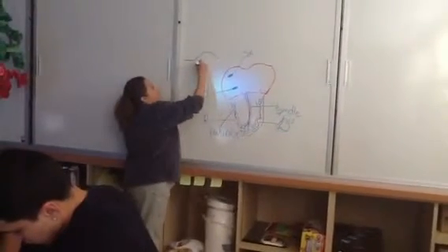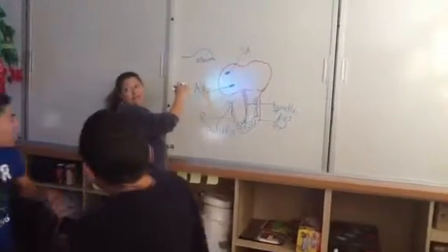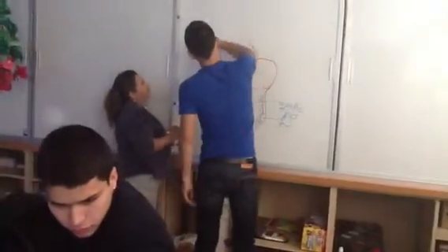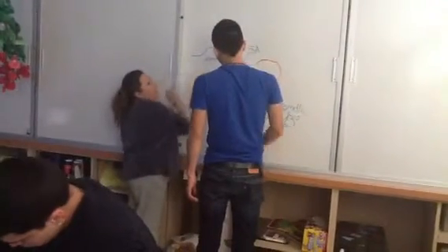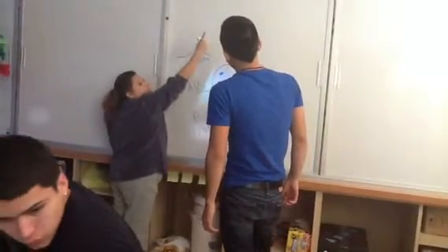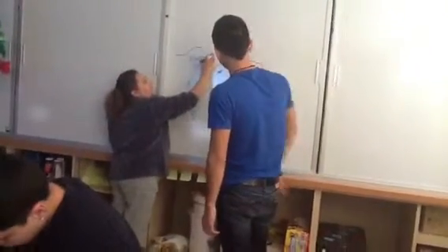So this is your atrium contracting. So this is the top half that contracts. So SA, AV is all in one. If this one takes longer, it'll be wider and flatter. So then it'll be flatter, and then before it makes the peak, it's going to be long in between here. It's supposed to be short. But if not, it'll flatten out and be longer.